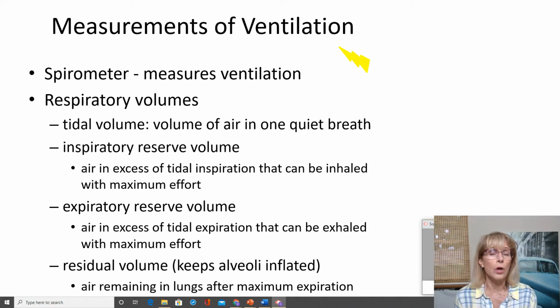If you were a pulmonary doctor, then you would be interested in many measurements of how well your patient is breathing, how well they are able to breathe. We will be covering just some of those measurements in the rest of today's respiratory lab. But believe me, there are a ton of them.